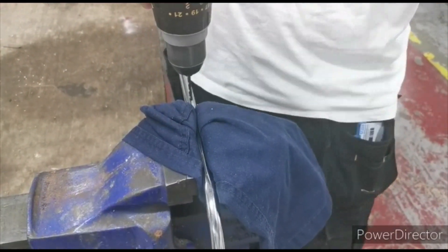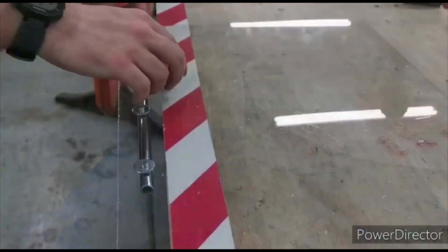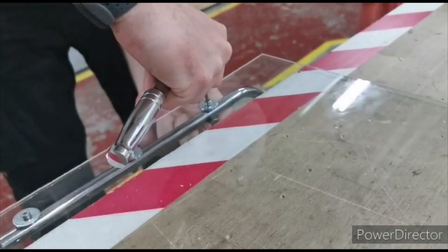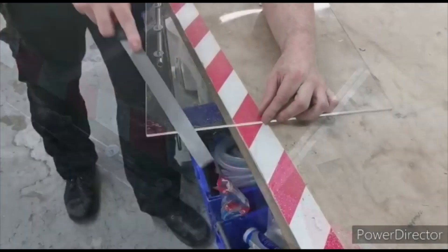In the next step, those two main elements are joined by three stainless screws with washers and nuts. Finally, the edges of the screen are smoothened with a file.